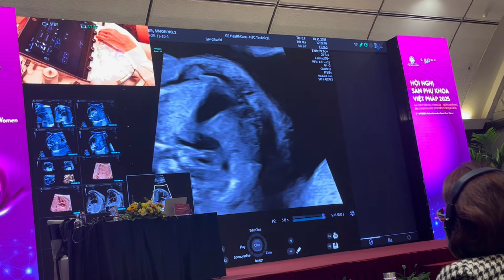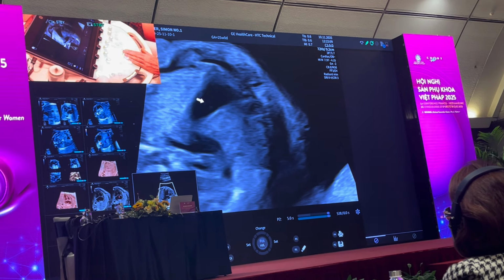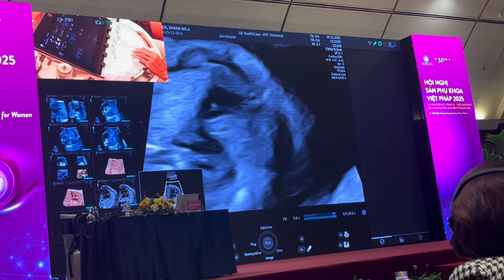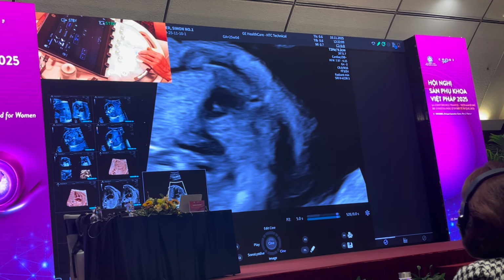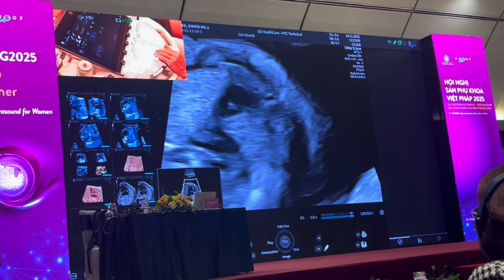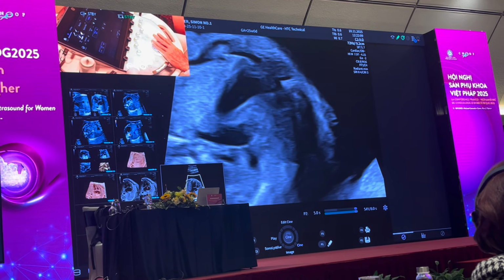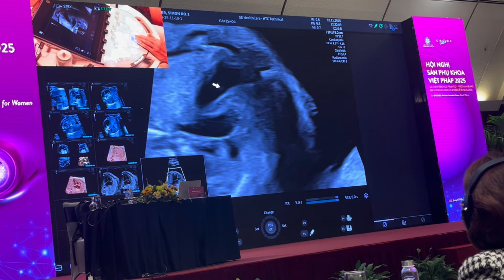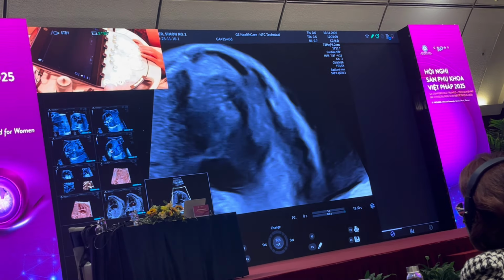So I magnify that in the jug. This is the pulmonary valve opening and closing. So I want to know about pulmonary stenosis, but this valve disappears completely. This is during ventricular diastole, the valve closes. This is during ventricular systole, where the valve completely disappears. There's just a little bit of the valve there, but in essence, the valve disappears.